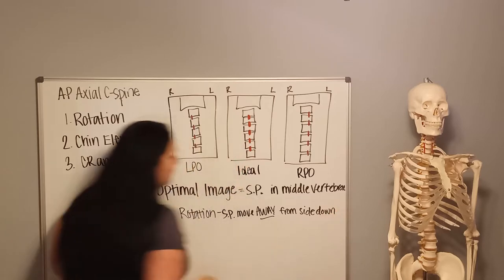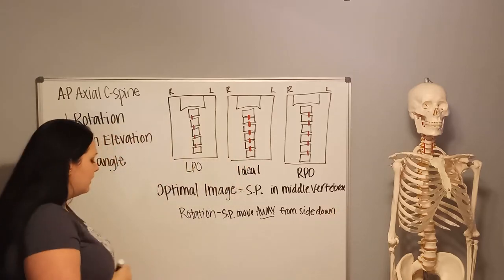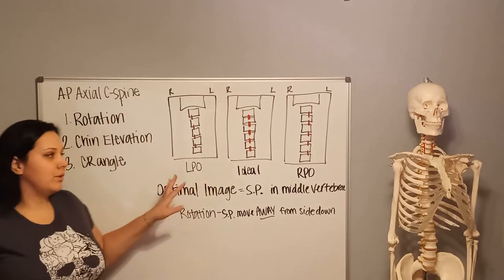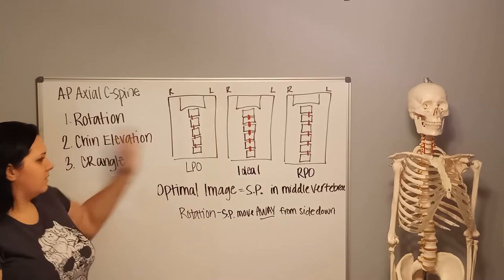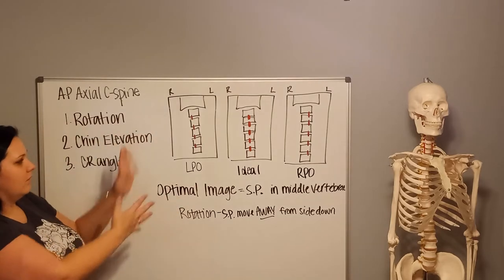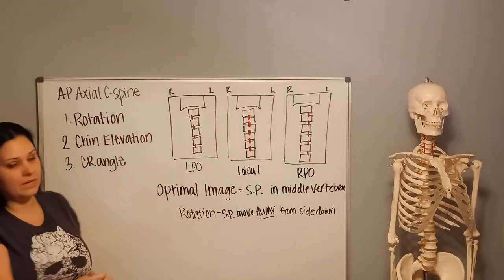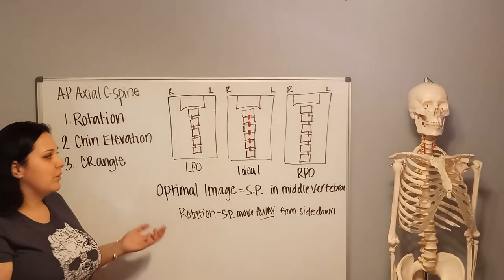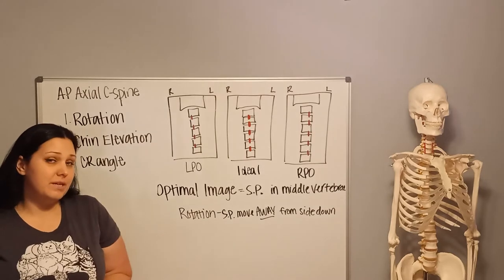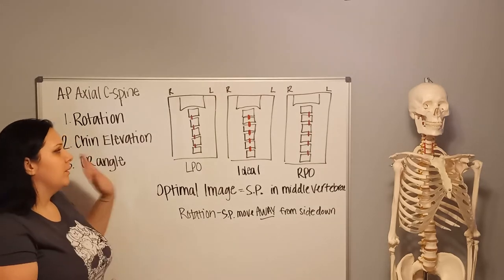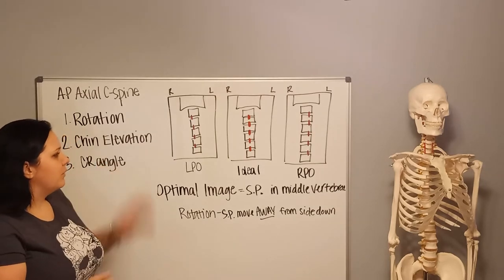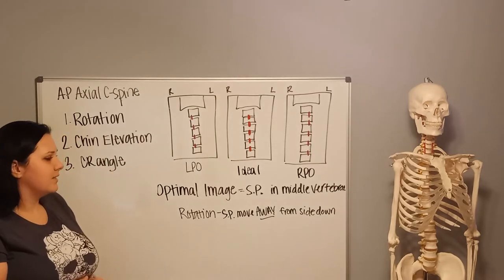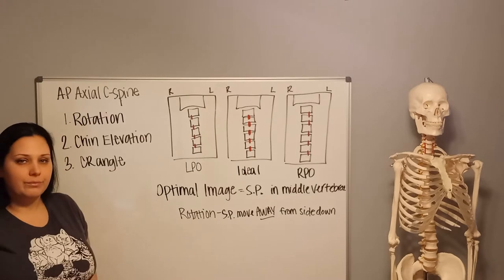To summarize rotation: in an optimal image, you want the spinous processes in the middle of the vertebrae. With rotation, the spinous processes move away from the side that's down — meaning the side closer to the image receptor. I'm going to pause the video to set up for the next piece, but I'd rewatch this if it's not making sense.